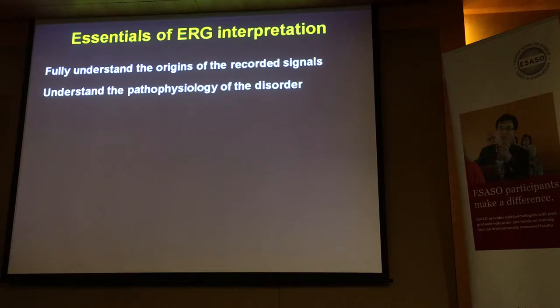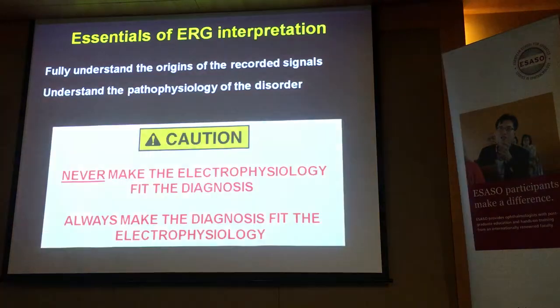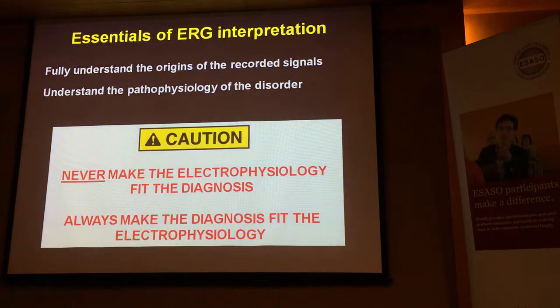And it's particularly true if anybody's reporting the ERGs on their own patients, because they've seen the patient, they've come to a clinical decision, they do the ERG, and they usually do the ERG to confirm their suspicions. And therein lies disaster, because you must always make the diagnosis fit the electrophysiology, and never ever make the electrophysiology fit the diagnosis. So if you have to prove yourself wrong, that's what you do.